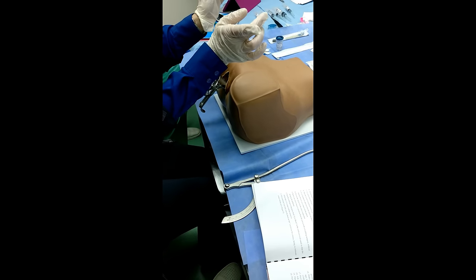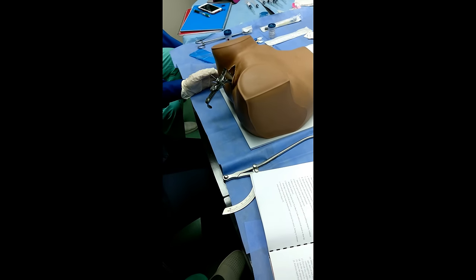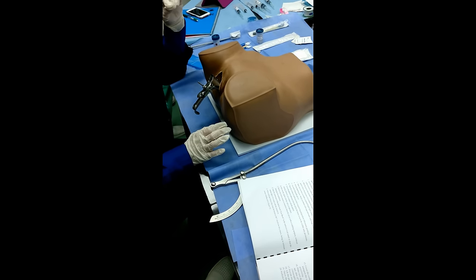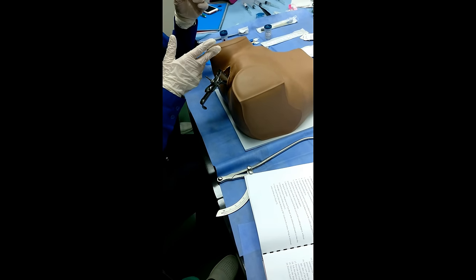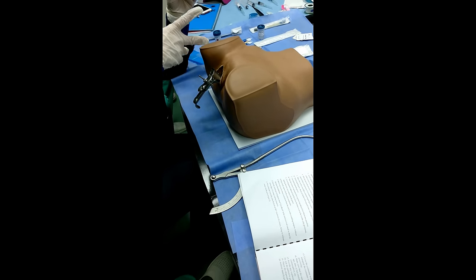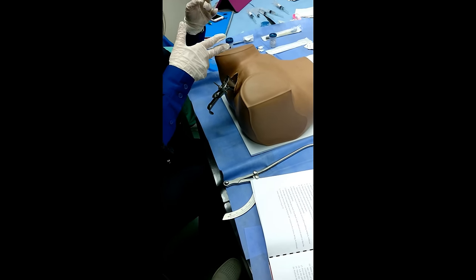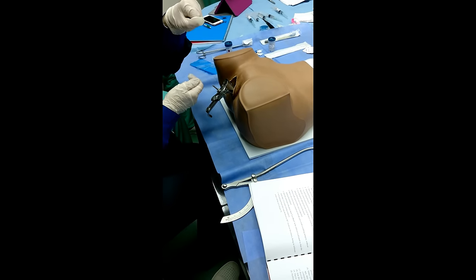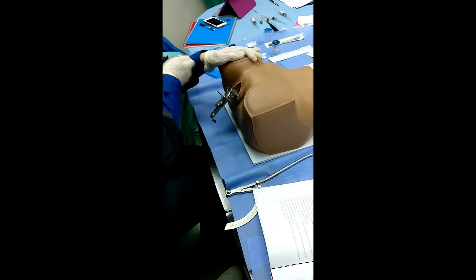Never horizontally. So, four zones should be applied: 4, 3, or 2, depends. For the exam, we'll be in 4 zones. Any procedure in gynecology, when we perform an aspiration, we should hold the cervix. We fix the cervix with the tenaculum to hold it because the uterus is mobile. So, we have to hold it to perform procedures inside. Otherwise, we can perforate.